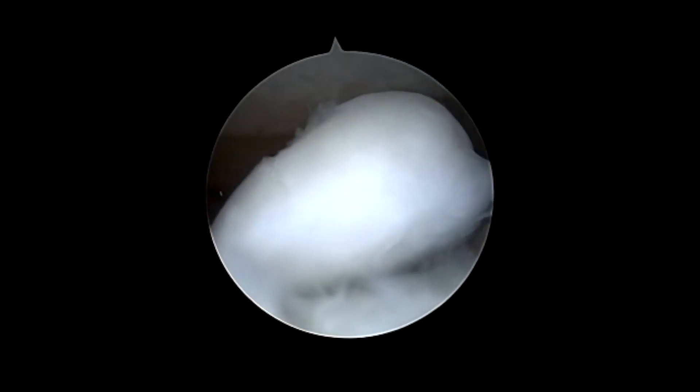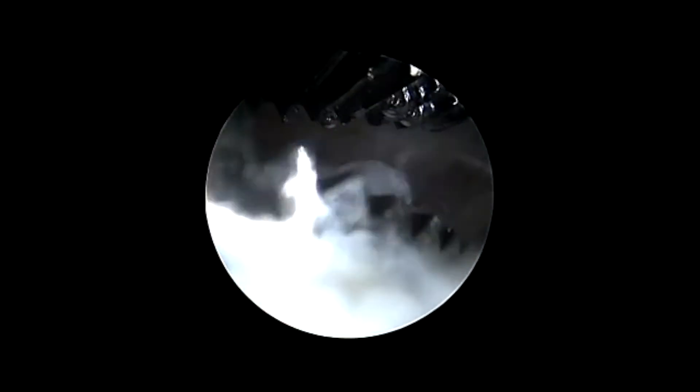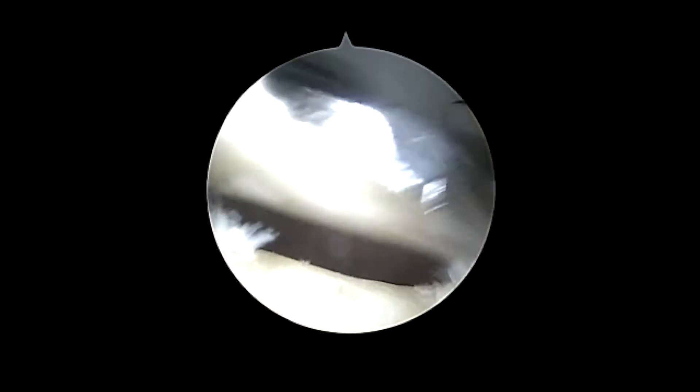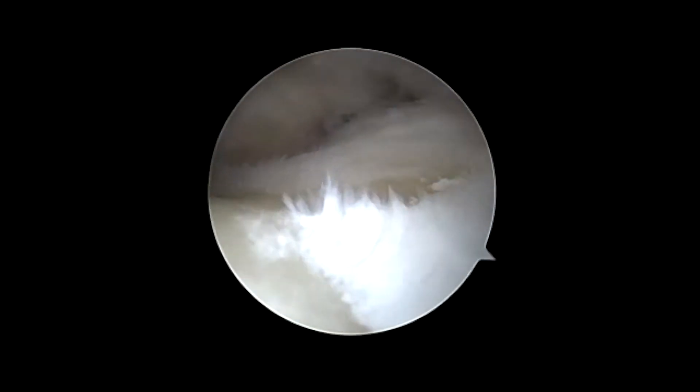An arthroscopic shaver is used to begin initial debridement of the thumb CMC joint, and a loose body is found. An arthroscopic grasper is used to remove the loose body, and then the arthroscopic shaver is used to continue performing the synovectomy of the CMC joint. The synovectomy is completed, and again there is noted to be significant cartilage loss on both the metacarpal side and trapezial side of the basal joint.